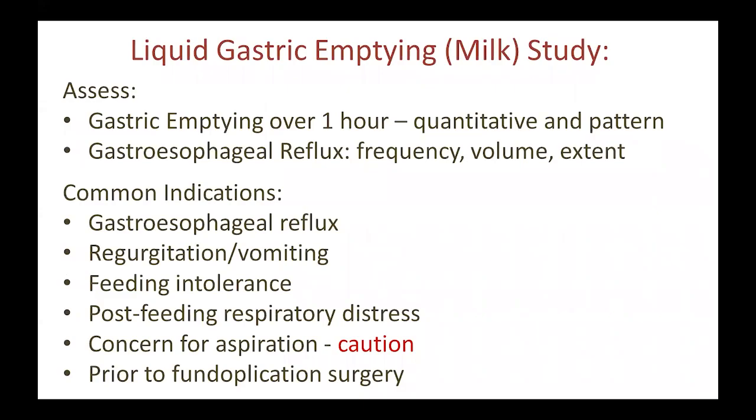So the liquid gastric emptying study, or milk study, allows us to assess gastric emptying over 1 hour, and we can look at both a quantitative measure of gastric emptying as well as the pattern of emptying, and also allows us to assess for gastroesophageal reflux, looking at frequency, volume, and extent of reflux.